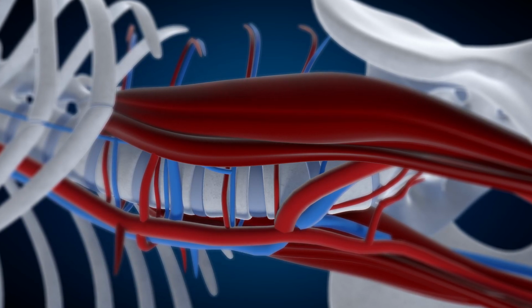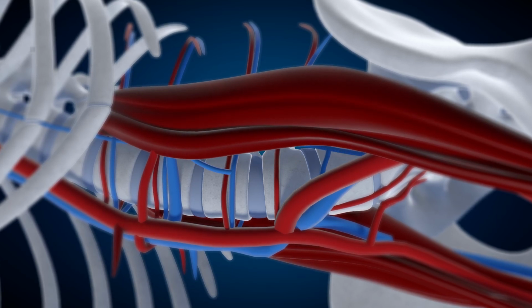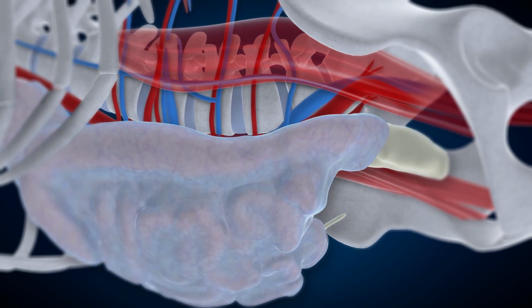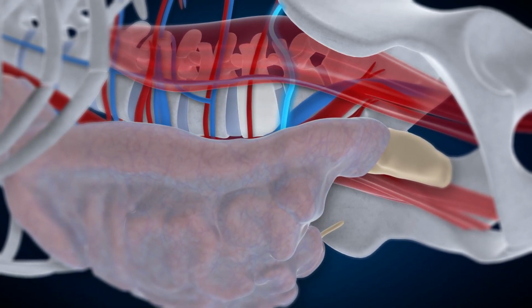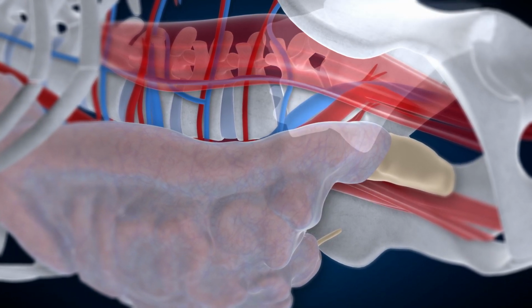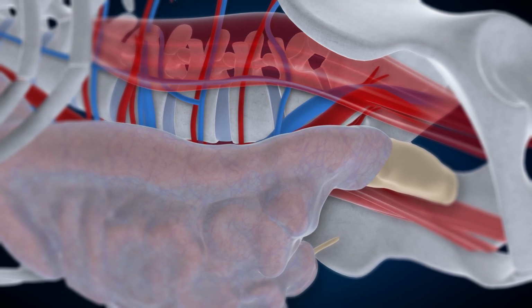The preferred starting position of the probe on the disc space is anterior to the psoas and away from the major vessels. An OLIF25 procedure works away from the peritoneum and anterior vascular structures. The iliolumbar vein may be observed in the L4-5 disc space of patients with transitional anatomy. For these patients, direct visualization is recommended to identify iliolumbar vein location.